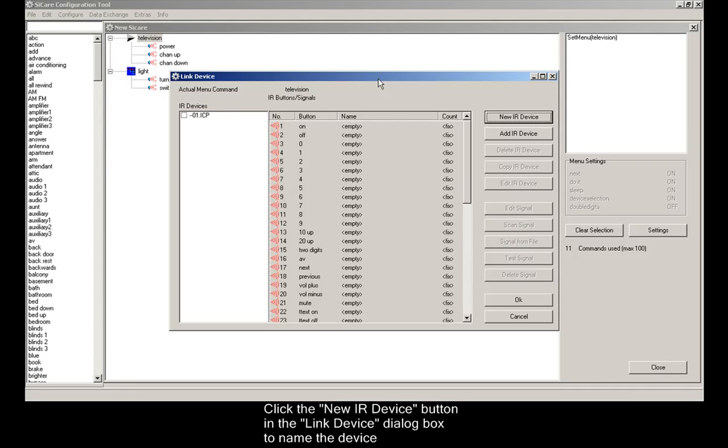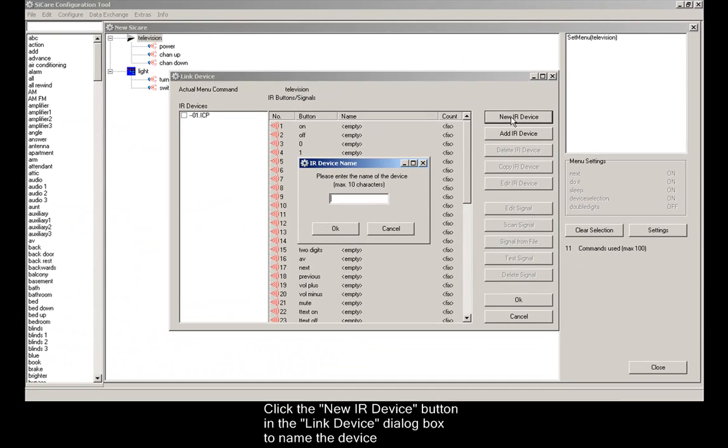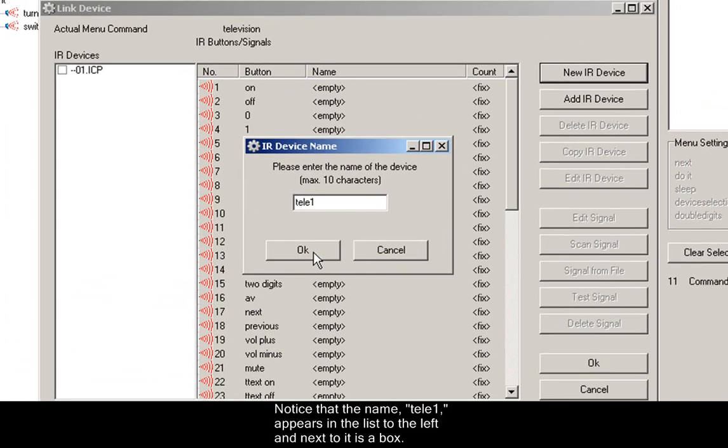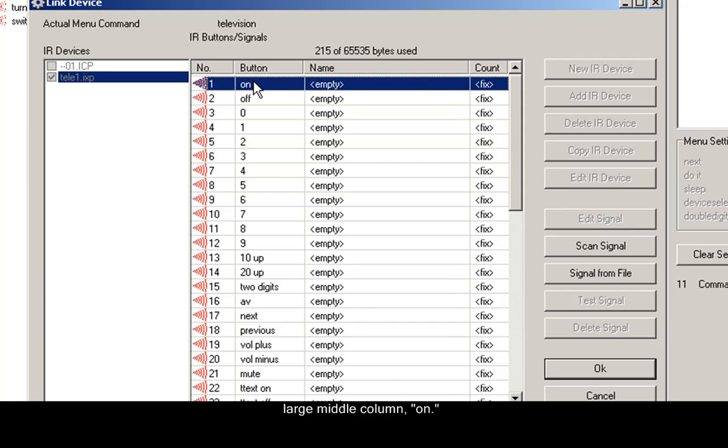Click the New Infrared Device button in the Link Device dialog box to name the device you are scanning in. In our case, we will call it Tele1. Notice that the name Tele1 appears in the list to the left, and next to it is a box. Click that box to select Tele1 and then click on the first item in the large middle column, On. This will be the first signal we scan in to turn the television on and off.